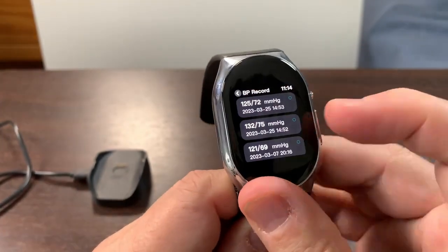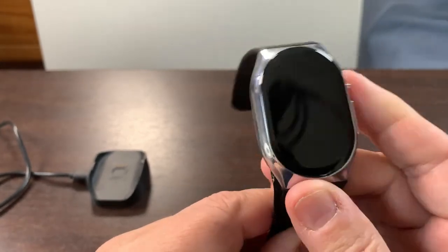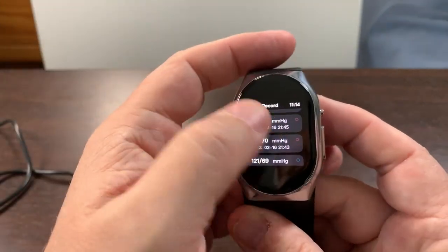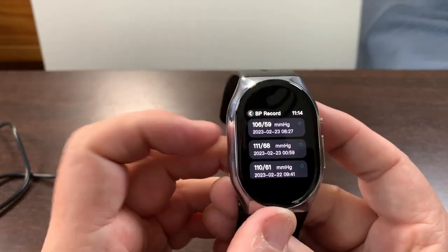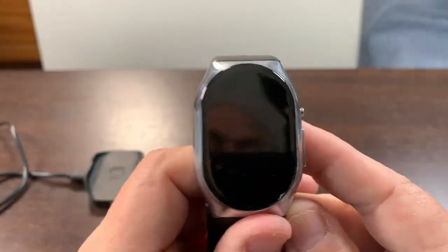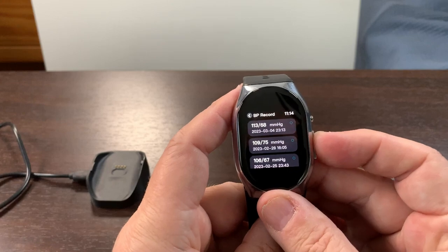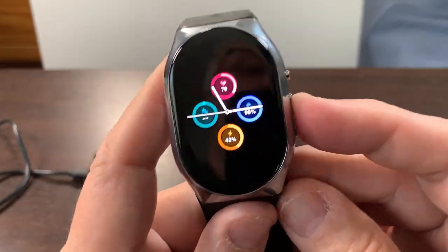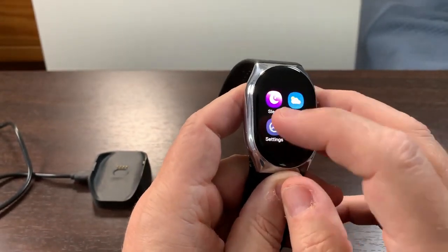I've always had trouble with cuffs and other blood pressure devices, and I needed to start tracking my blood pressure. I've taken my blood pressure quite a bit with this and gotten varying results, but I actually think it's been better than the wrist cuff I'd been using. I've had some terrific numbers because I had a heart attack and needed to go on meds, and I needed to see how the meds were working.